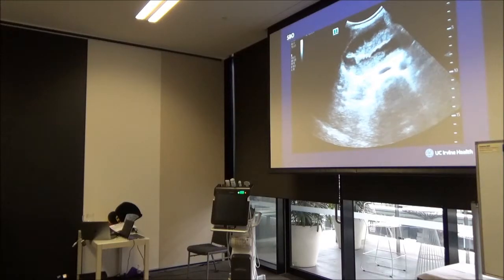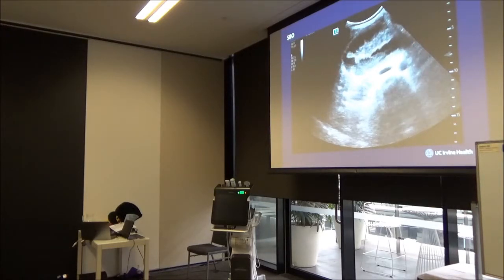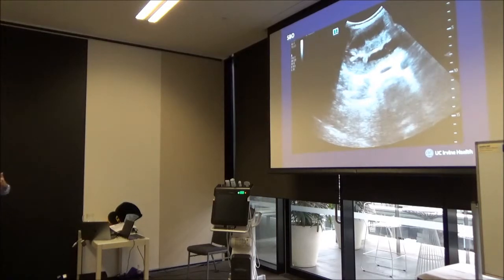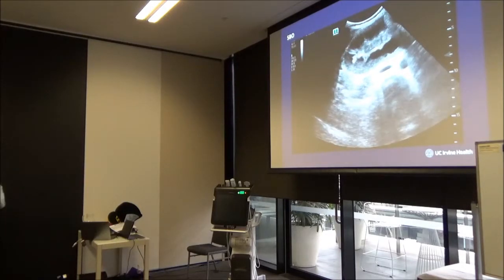It depends on the surgeon. I can get the patient admitted to the hospital to a surgical service based on our point-of-care ultrasound for a whole host of surgical conditions. Some of my attendings don't feel as confident with ultrasound, and they don't even bother the surgeon until they get a CT scan. We are credentialed by the hospital to interpret our own point-of-care ultrasounds, and intestinal ultrasound is one of the areas of credentialing. It's in the medical imaging system for the hospital, and we have a report, so it looks pretty legit, I think, to the people upstairs.